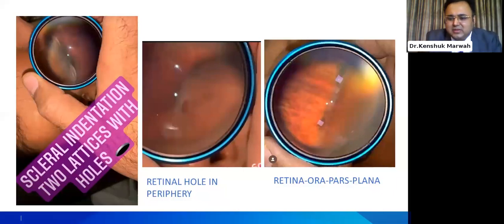The images actually speak for themselves. We usually talk about the image and the magnification, but when we do it clinically, we learn and gain more experience of what an indirect BIO can do. It all comes with practice. Even after finishing OPD, one must spend time, and it is all about maneuvering your hand and tilting the lens. I will talk more about that.